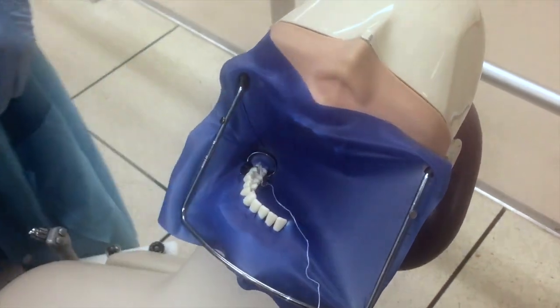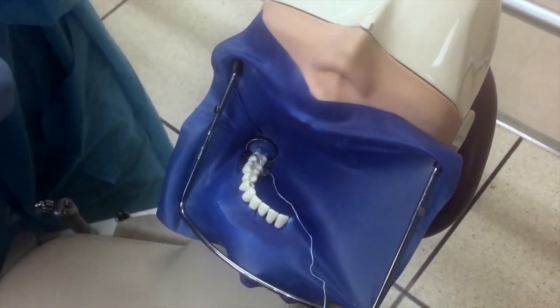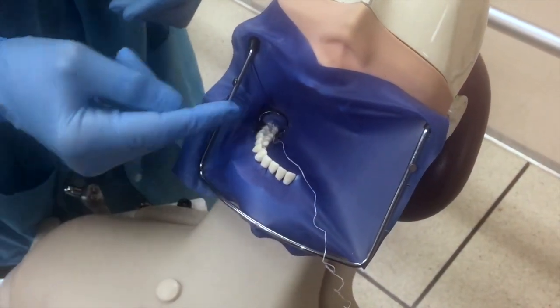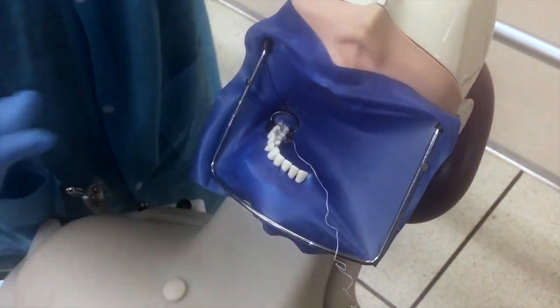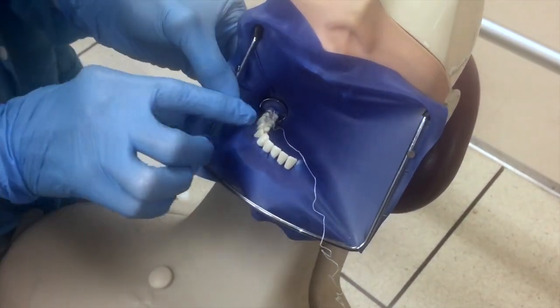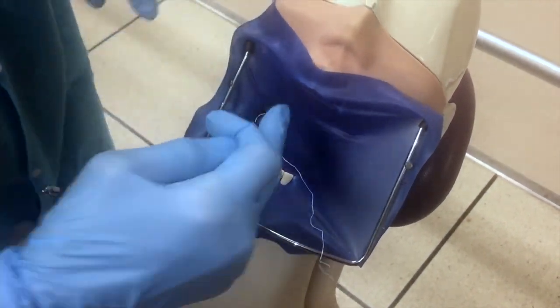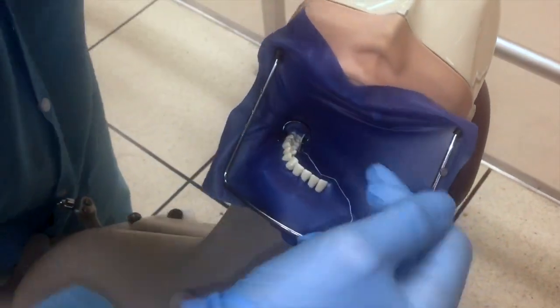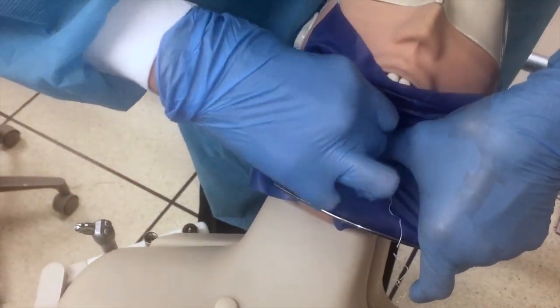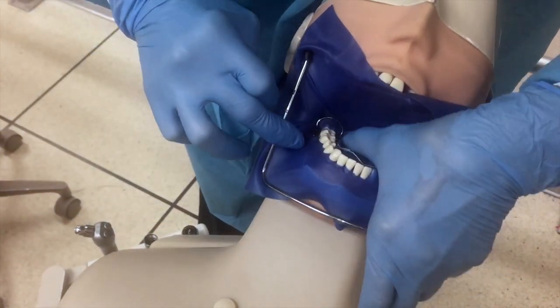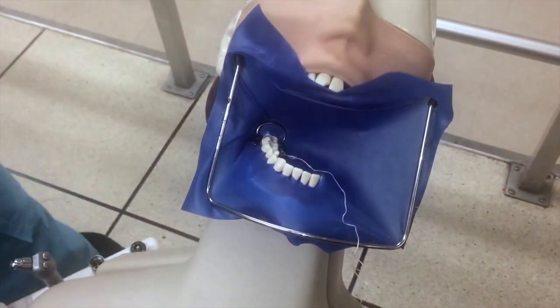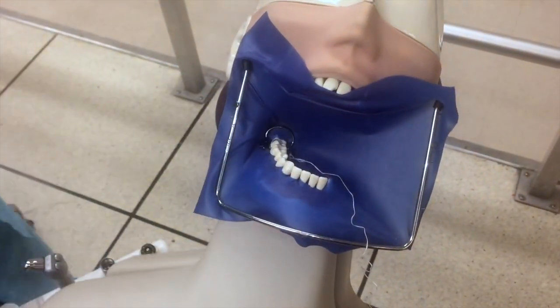Now what's the next thing? We want to look at what we've done. Do we have saliva? Is the rubber dam on the way it needs to be? We haven't done one thing. You see these holes? Those are the holes that we speared with our forceps. Saliva is going to bubble up through those holes. So what do we do? We stretch the rubber dam underneath the hole. So now our teeth are virtually waterproof, so to speak.